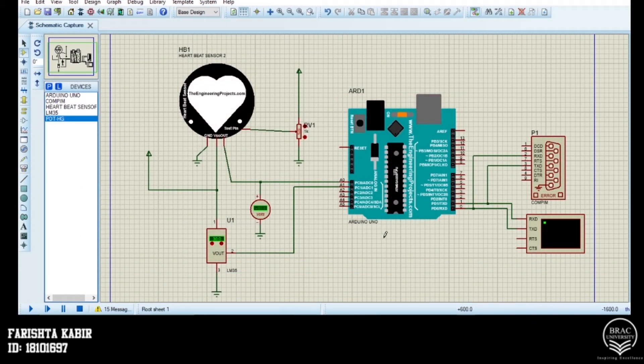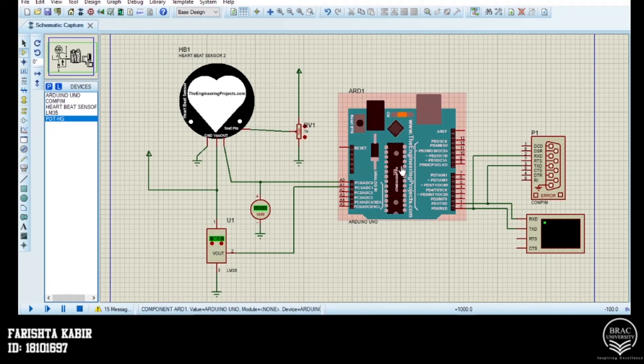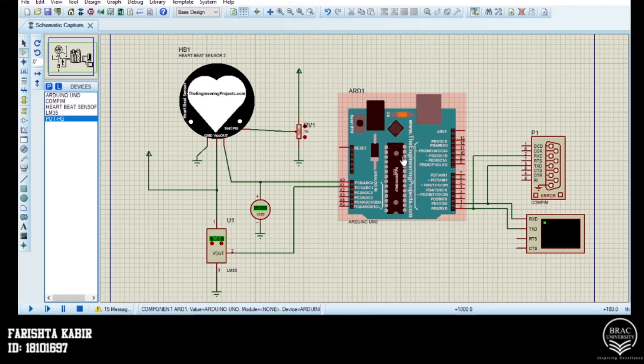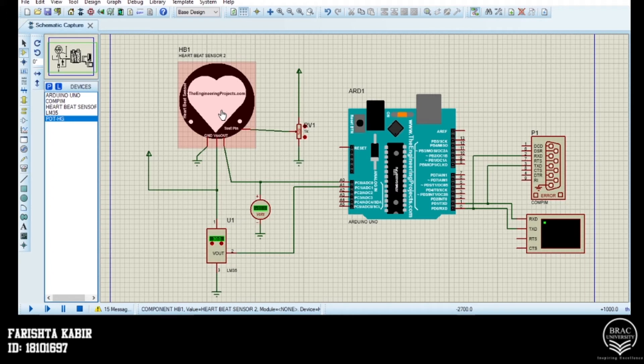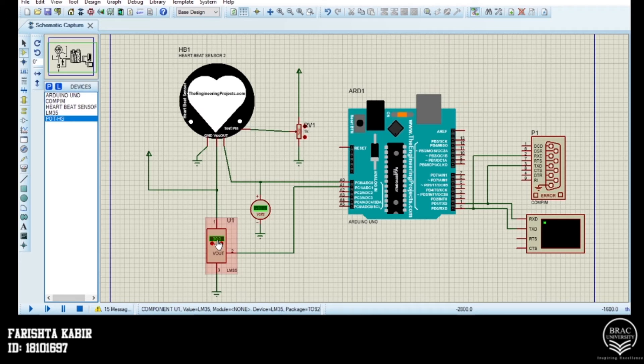In our virtual circuit, we have used Arduino Uno as the microcontroller of the system. Then comes our sensors. The heartbeat sensor that senses the heartbeat from the human body pulse. The LM35 for giving us the temperature count of the human body.